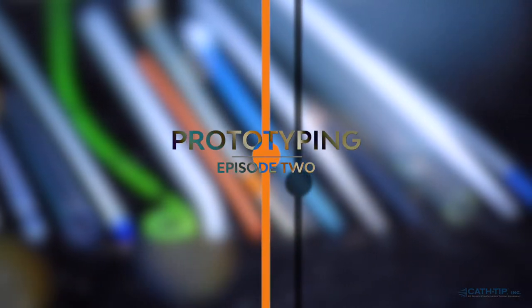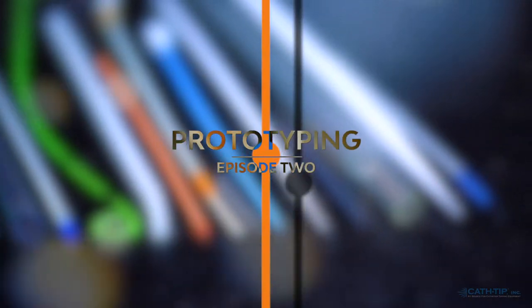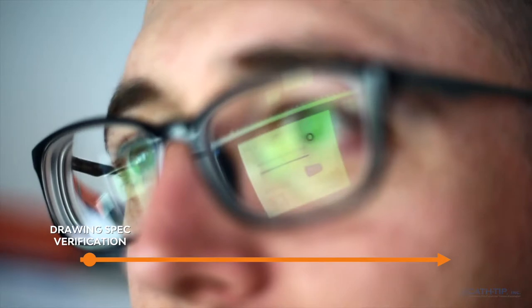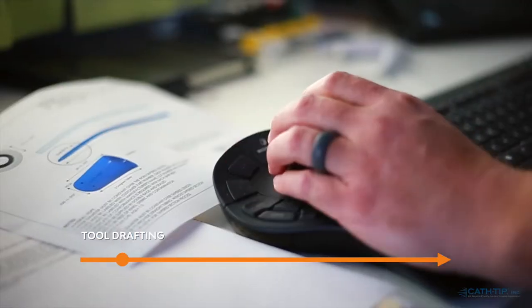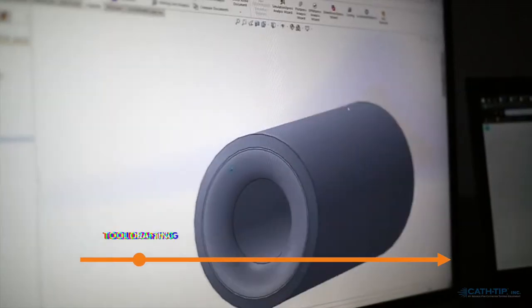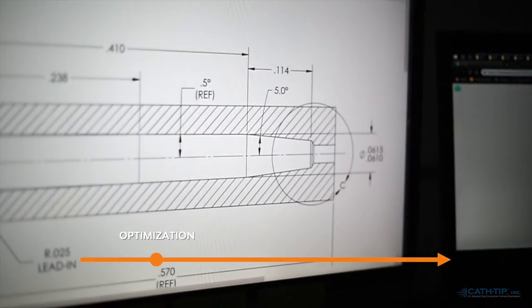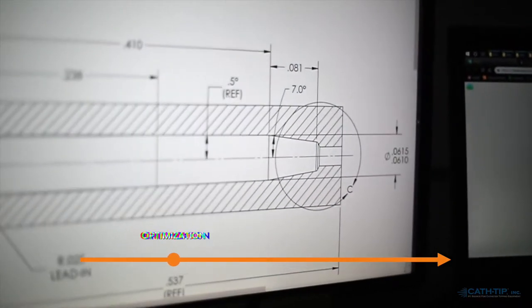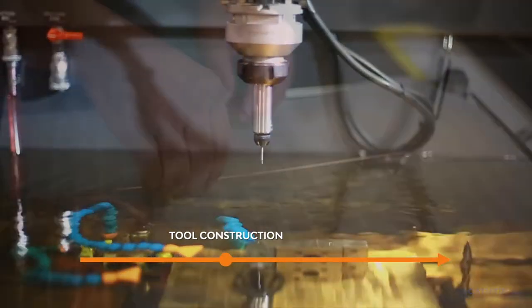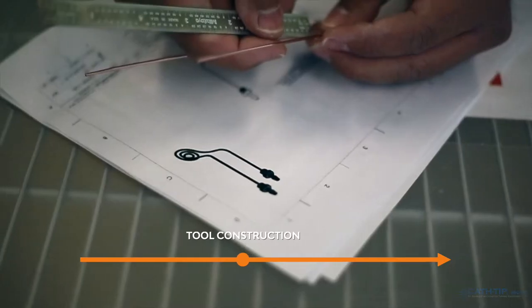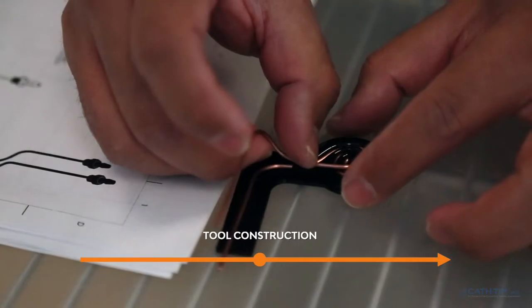Feasibility is established and you need prototype samples. We draw up the custom tools and options for best performance. We then fabricate the necessary dies, mandrels and any other tooling elements needed.